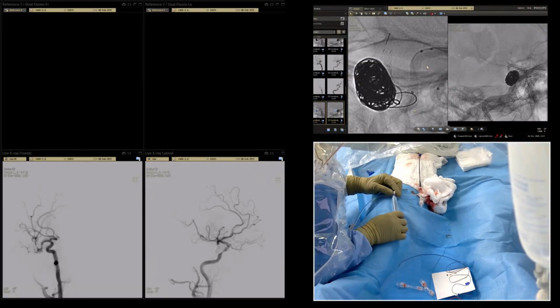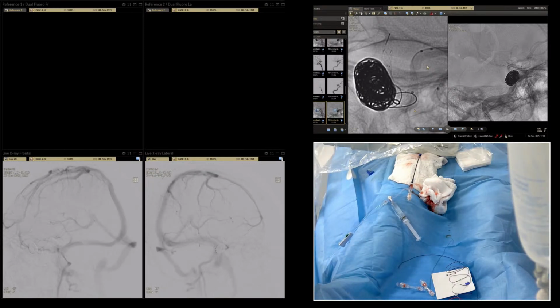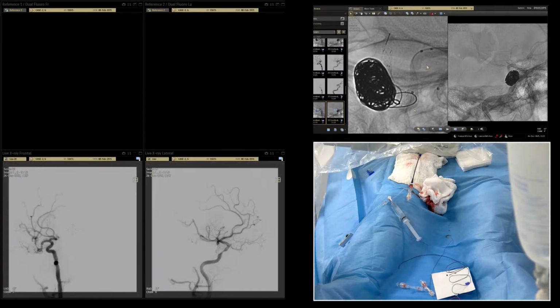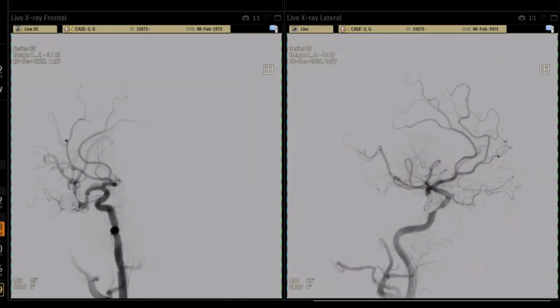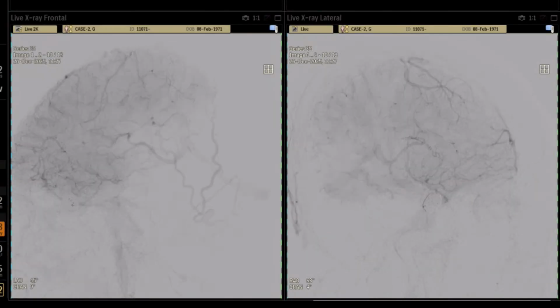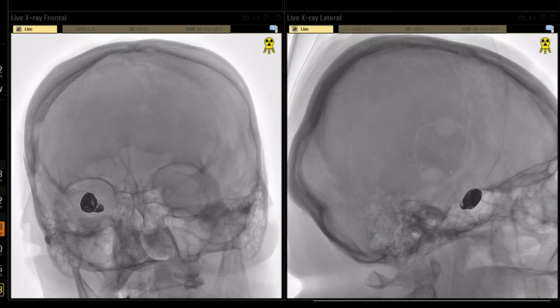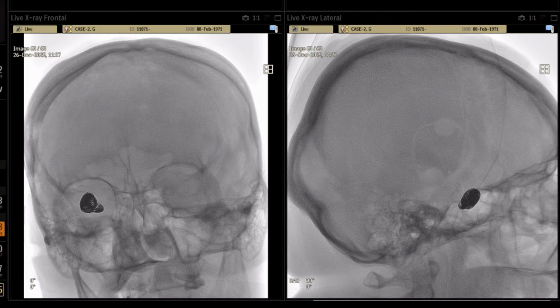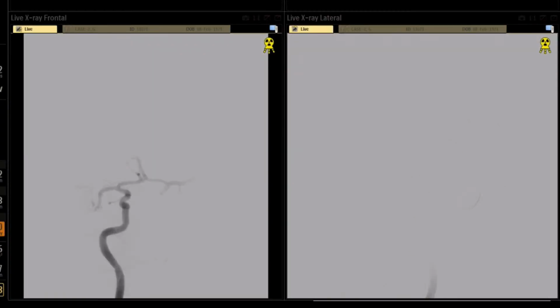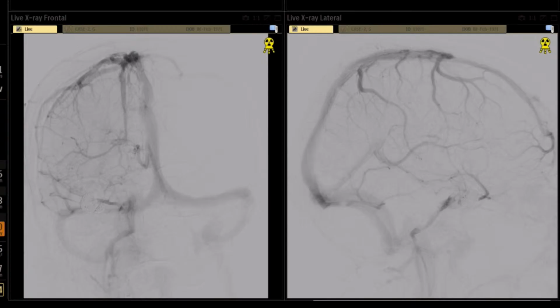You did it. We are working more than 30 minutes, and I think if in the future it will need an additional stent, then we can place one more in the future. Yes, the territory is clear.